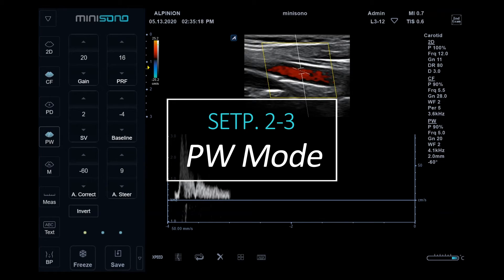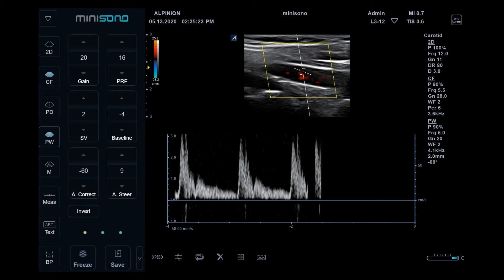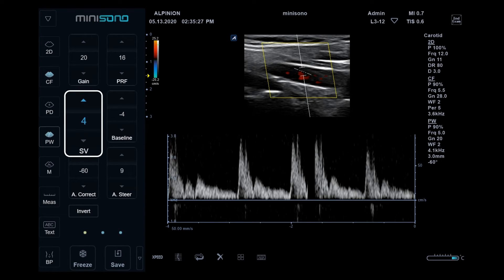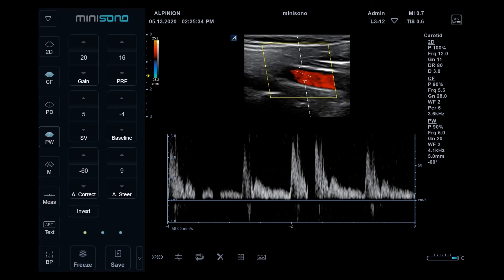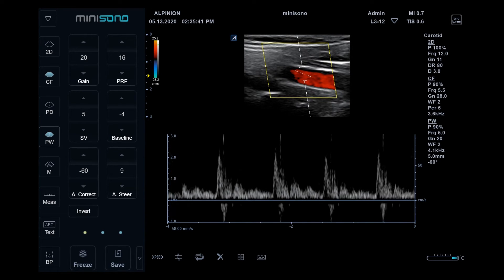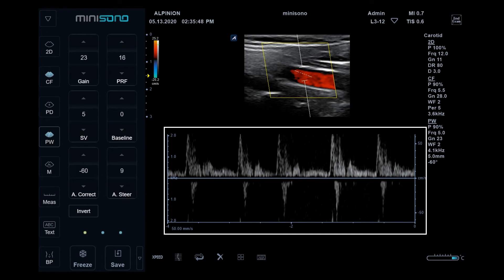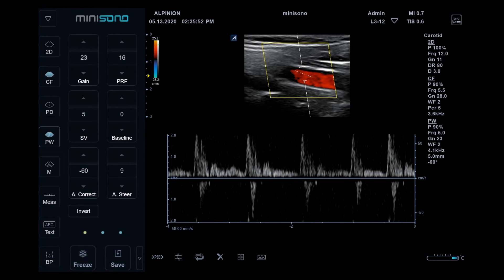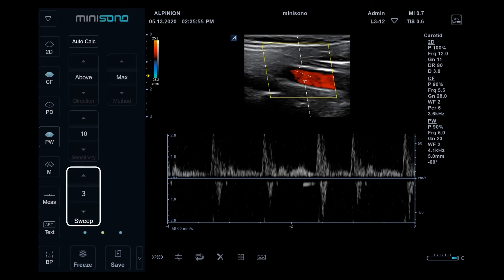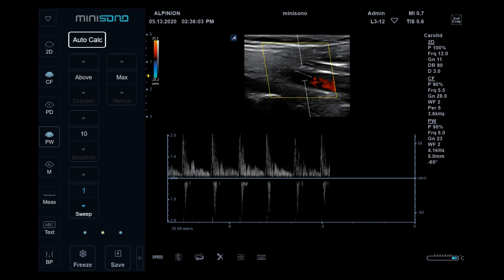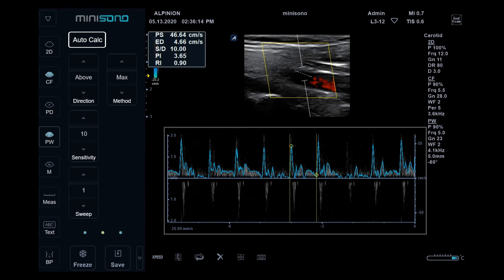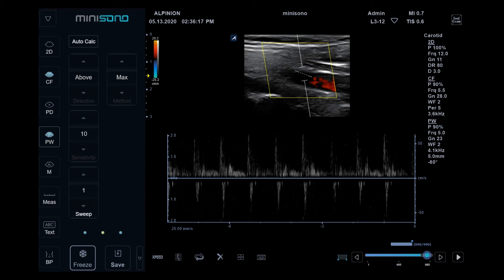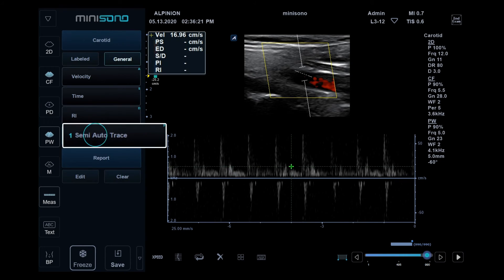Pulsed Wave mode: locate the sample volume. Depending on the application, adjust the sample volume and angle correction, then tap PW again. The Doppler spectrum appears. X-speed is an auto-optimizing feature that lets you easily optimize the velocity scale. To adjust sweep speed, change the control page and tap the button. If you activate auto-calculation, the peak systole and diastole results will appear automatically. This is for primary check; to report the result, we recommend using semi-auto trace in measurement.